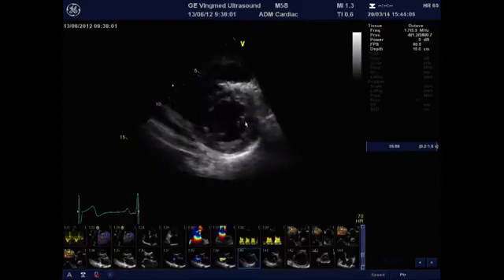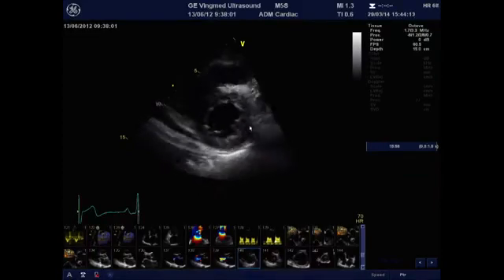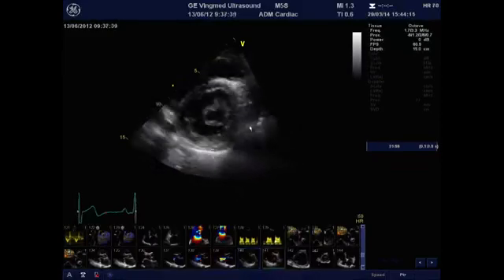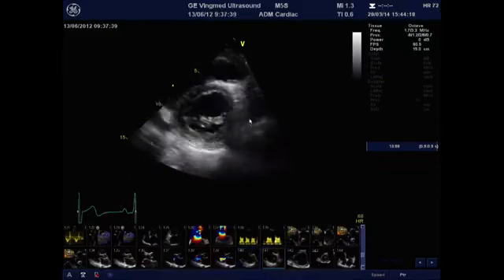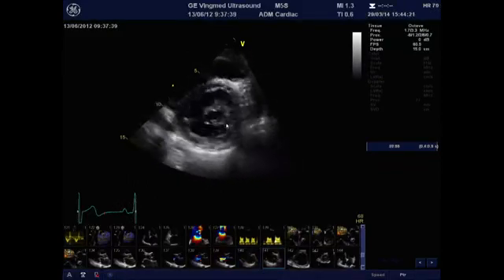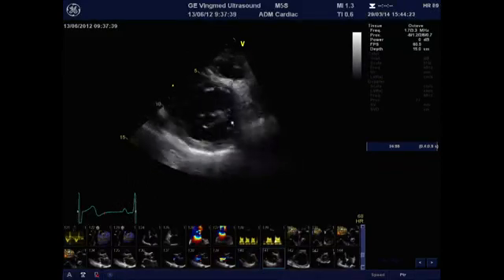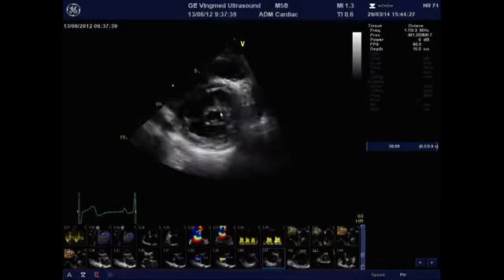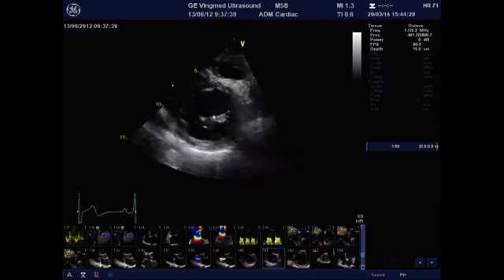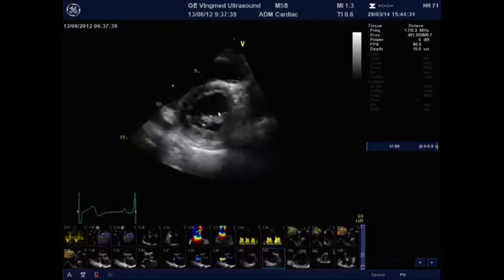the leaflet tips, because you will start scanning further to find the morphology of the mitral valve also in the parasternal short axis view. And by going upper, you see here that I'm just moving the probe from the papillary muscle to the level of the mitral valve opening, and I'm seeing here beautifully the mitral valve orifice in diastole, which has a fish mouth appearance.